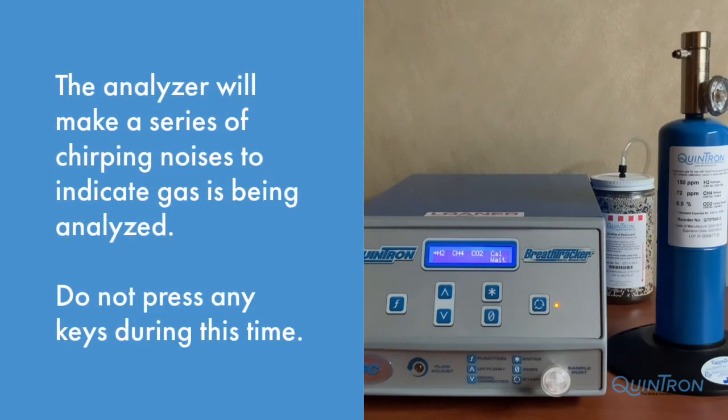During calibration, the analyzer will make a series of chirps letting you know that analysis is occurring. Under each gas, as it's being analyzed, the values will be displayed. The entire calibration process takes about 90 seconds.